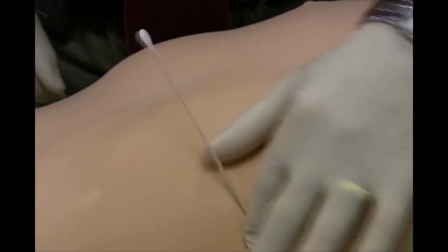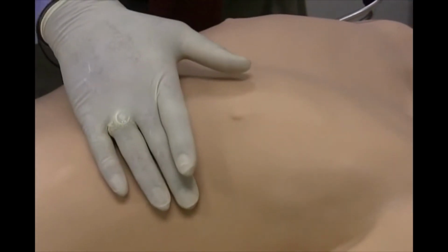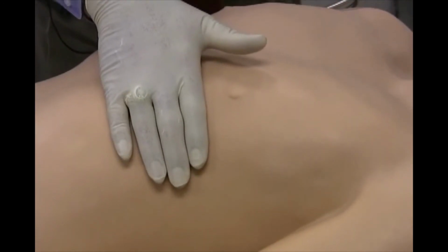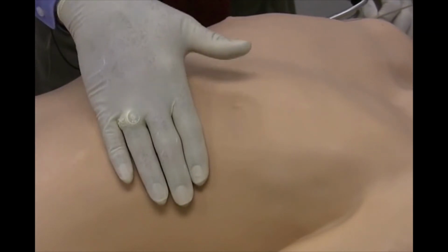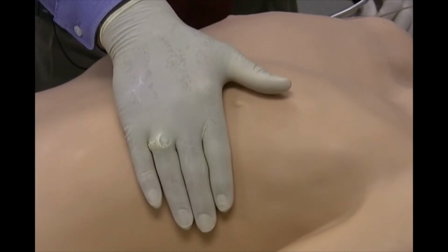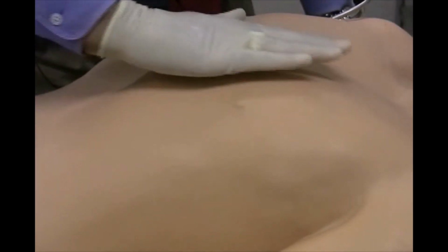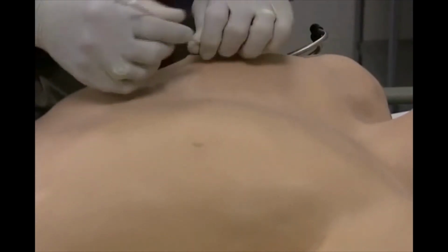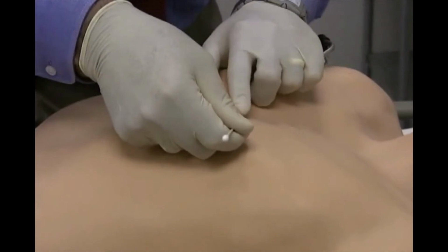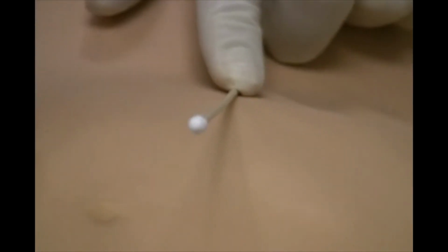So if you're feeling for this, and you put your hand way out there, you notice, oh, I feel something out here. It's fairly large. This thing is much larger than a quarter, and it has 3 components. And you're going to think in your head the patient probably has a fairly diseased heart. And moving over here, you put your hand right here. You can feel that there's a right ventricular lift right here. And it's 3 components as well.